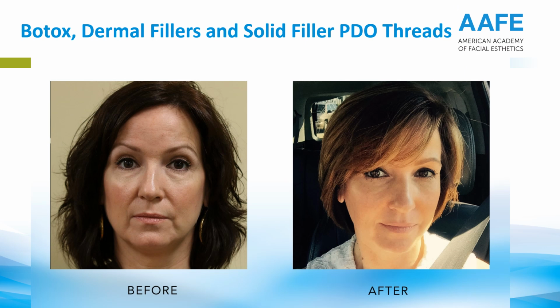You lift them up first, and that's the sequence usually: you lift them first, then go back with fillers and botulinum toxin. Many times you can do the toxin, the neurotoxin, the same day as the PDO threads or before. It really doesn't matter. Absolutely want to give them, and listen carefully, those of you who do threads.